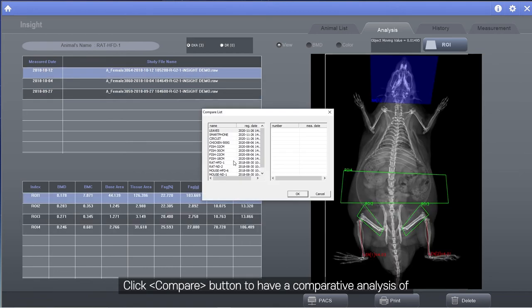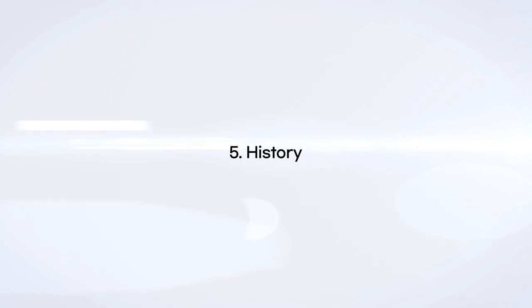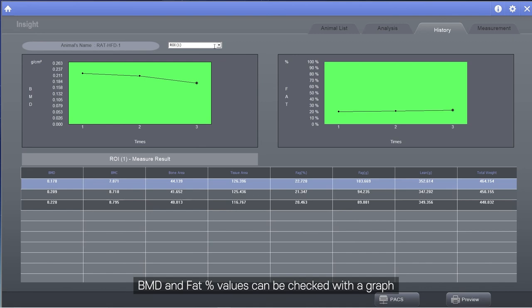Click Compare button to have a comparative analysis of two different study results and images simultaneously. When you complete the analysis, check History window to compare values for each ROI for all measured images. BMD and fat percentage values can be checked with a graph.